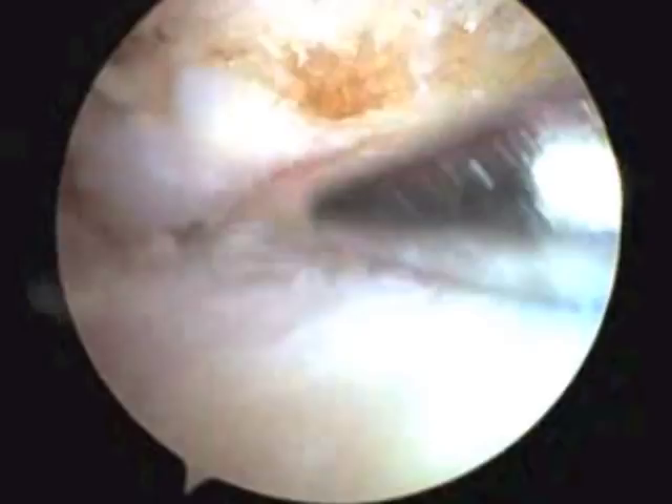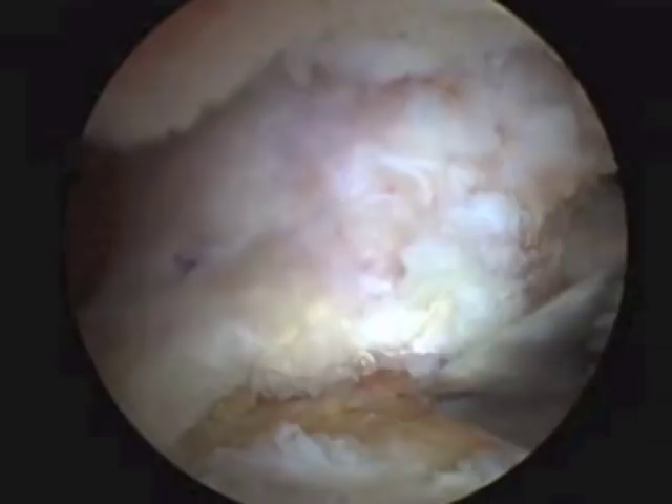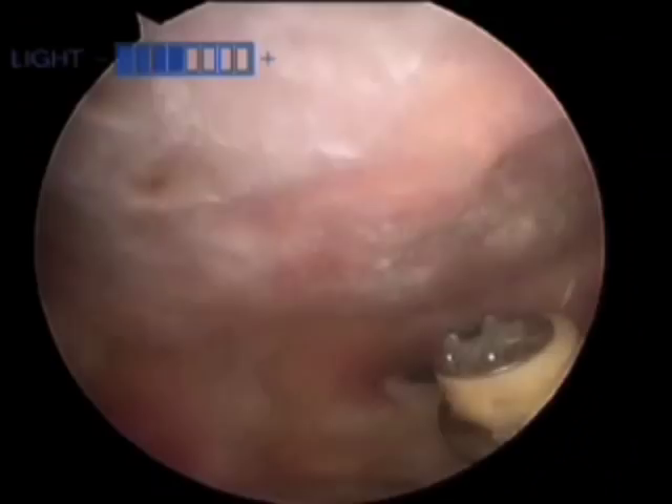Here is a view of another patient's shoulder. Again, we're looking at the right shoulder from behind. He is a professional rugby league football player and his clavicle is even worse. He's got almost no cartilage on the end of the bone, and he has a large spur formation and cysts on the end of the bone. This would be very painful.